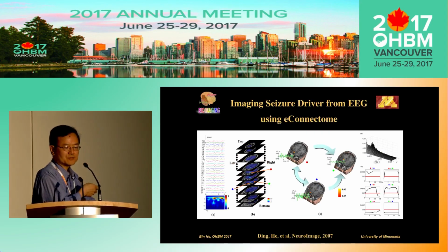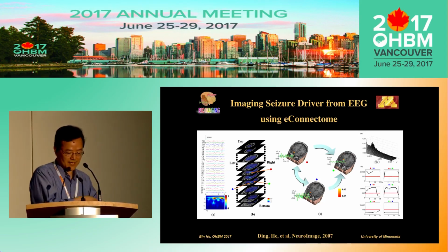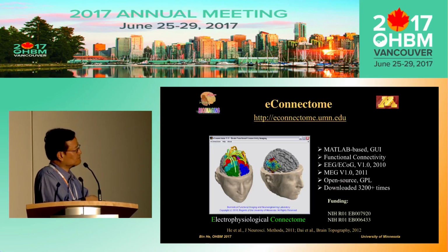This approach, we have applied to the epilepsy problem and found it quite useful. You can see that first of all, we do beamforming scanning, and then depending on that result, we get 3 possible source candidates. We perform Granger causality. We found that this one and this one are true seizure sources, and this one is not, which had a 100% success rate in the 20 seizures that we studied.